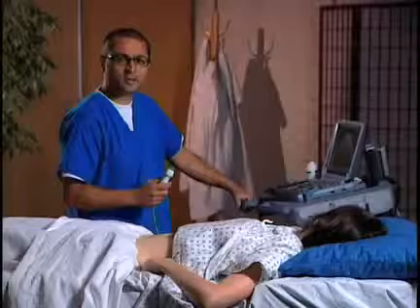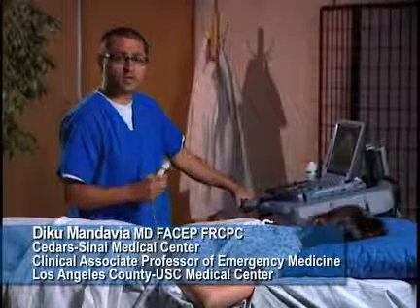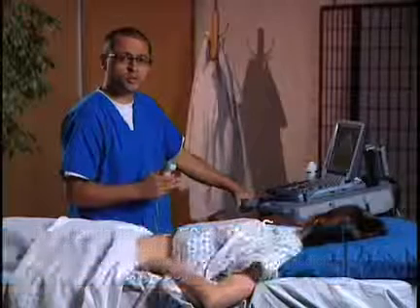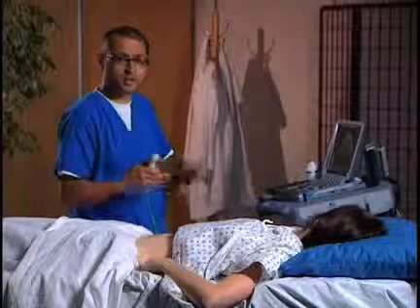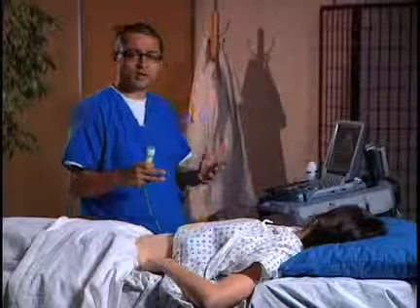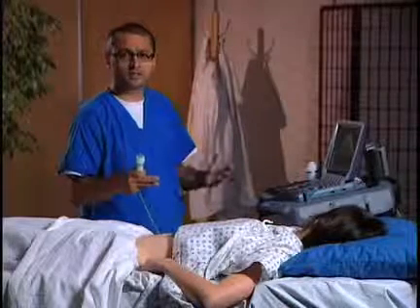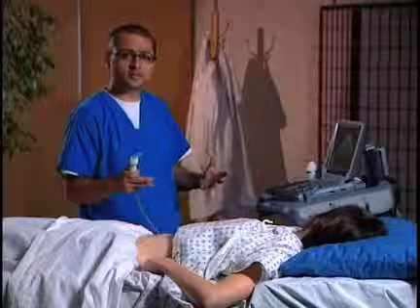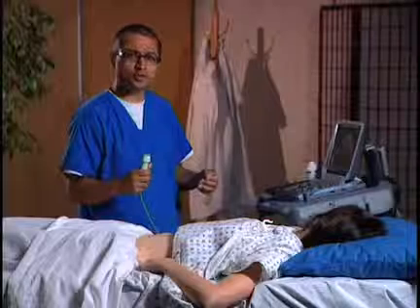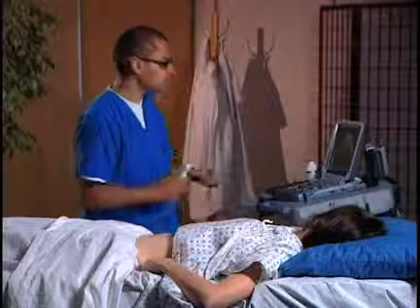In evaluating first trimester pain and bleeding, a pelvic ultrasound is a critical part of the evaluation. We're going to go ahead and take you through the first part of this examination. Our goal in the emergency department is to identify an intrauterine pregnancy. We can evaluate the uterus in two basic ways. One is a transabdominal approach and the other is a transvaginal approach. Right now I'm going to show you the transabdominal approach.